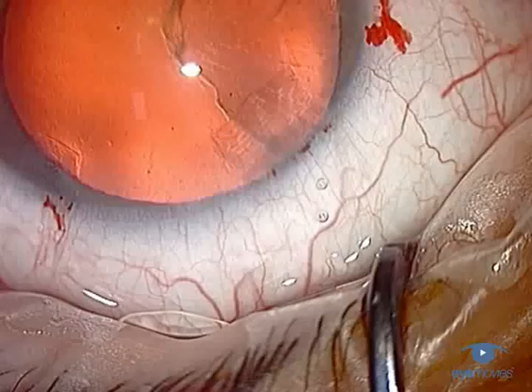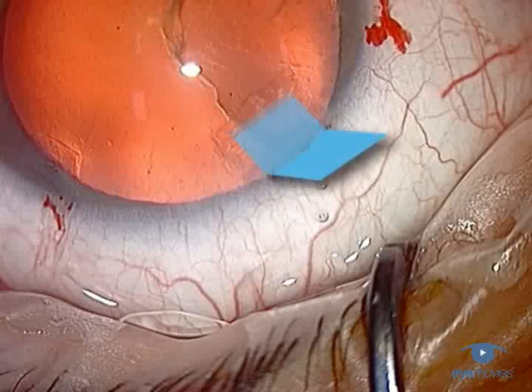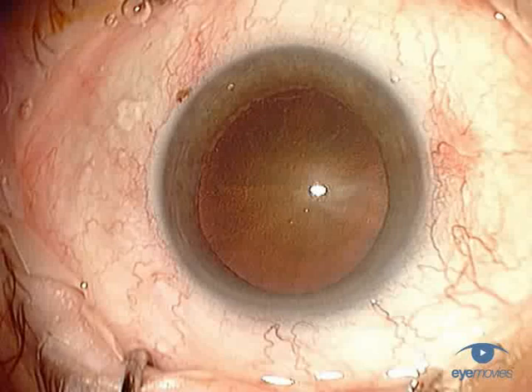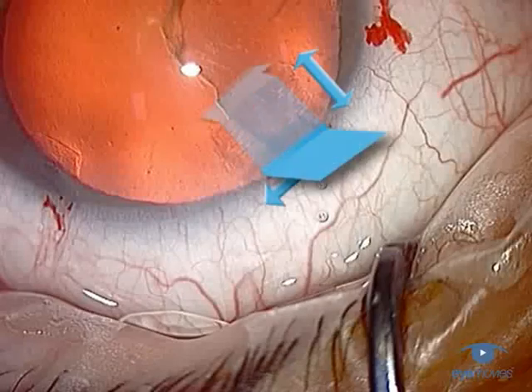Secondly, and finally, let's look at the issue of the internal contour of the incision. This can be constructed either as a simple one-step or stab incision, a more stable two-step grooved or hinged incision, or a very robust 3-step profile used for wider incisions. All 3 profiles can be corneal or scleral, and if properly constructed, create stable and self-sealing incisions. Their detailed construction techniques are shown in other videos in this section.